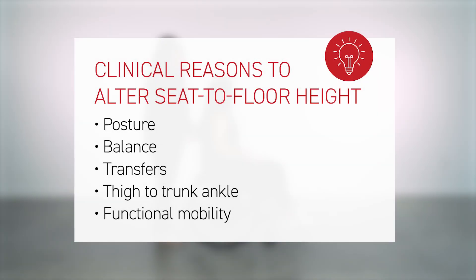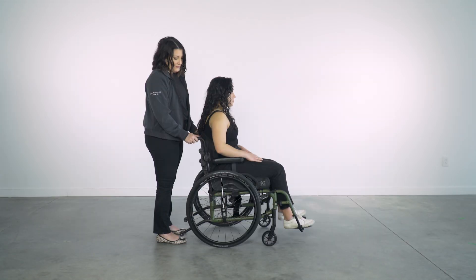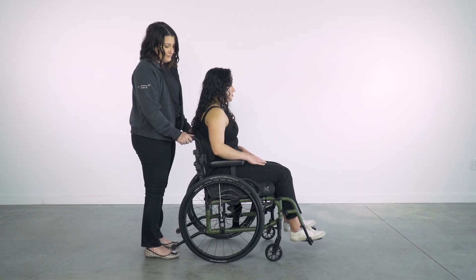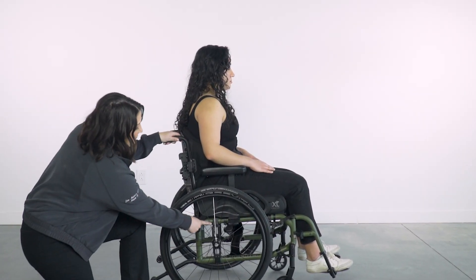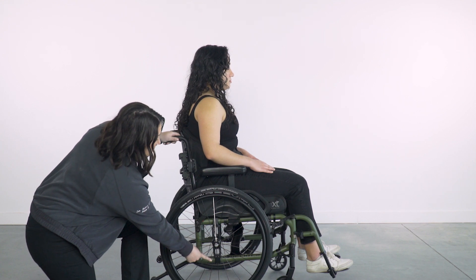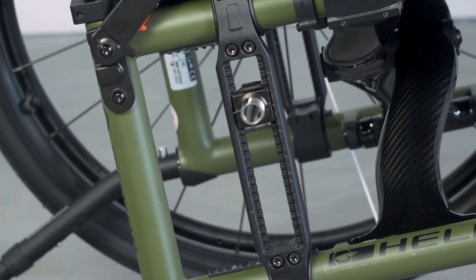Now that we have addressed horizontal placement, let's look at vertical axle adjustability. Vertical axle adjustability determines where the client sits between the rear wheels. It also plays a role in seat slope and seat-to-back angle. The rear wheel is vertically adjusted through the axle plate. Range and incremental adjustments will vary between wheelchair type and style — this wheelchair has 21 options in quarter-inch increments.